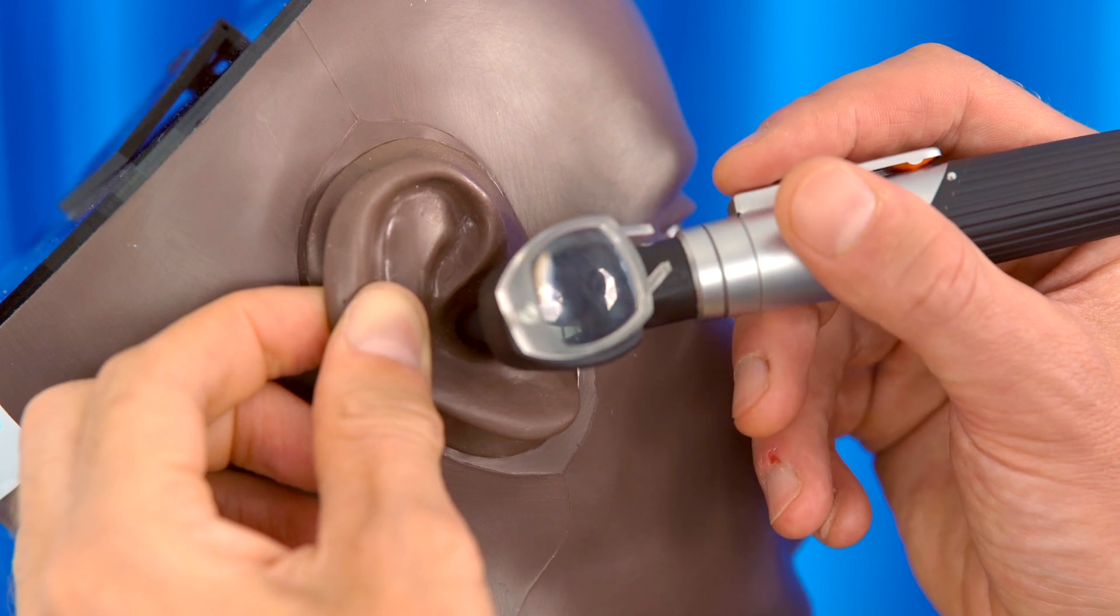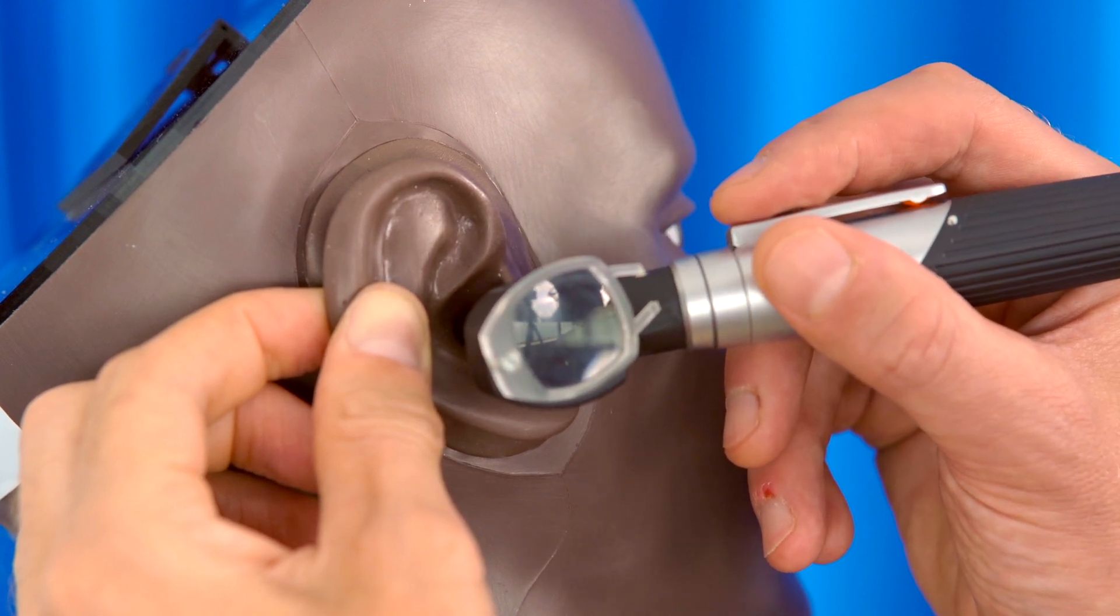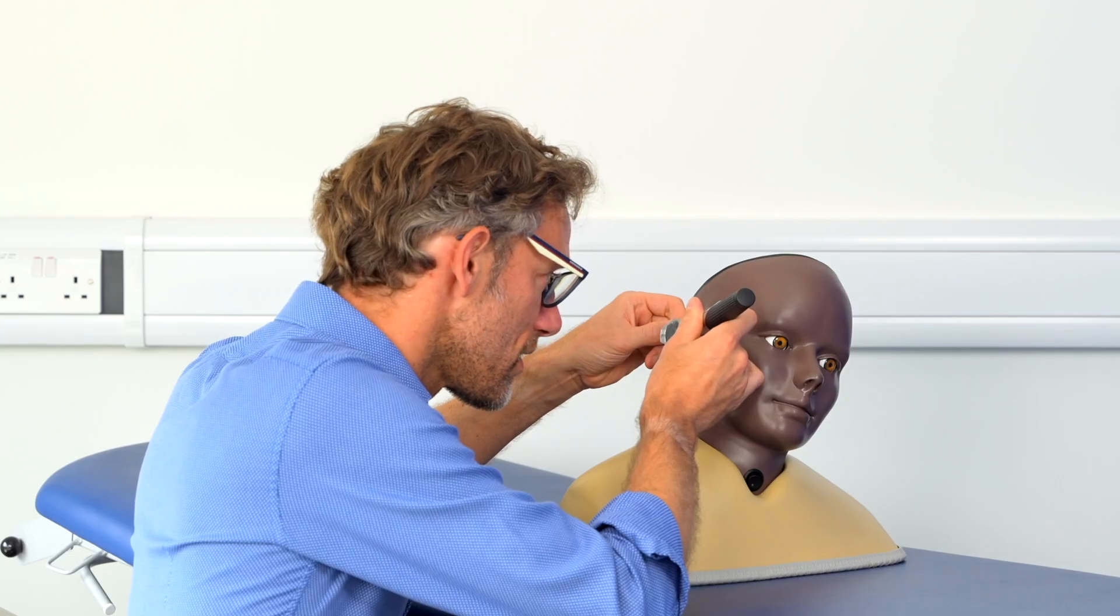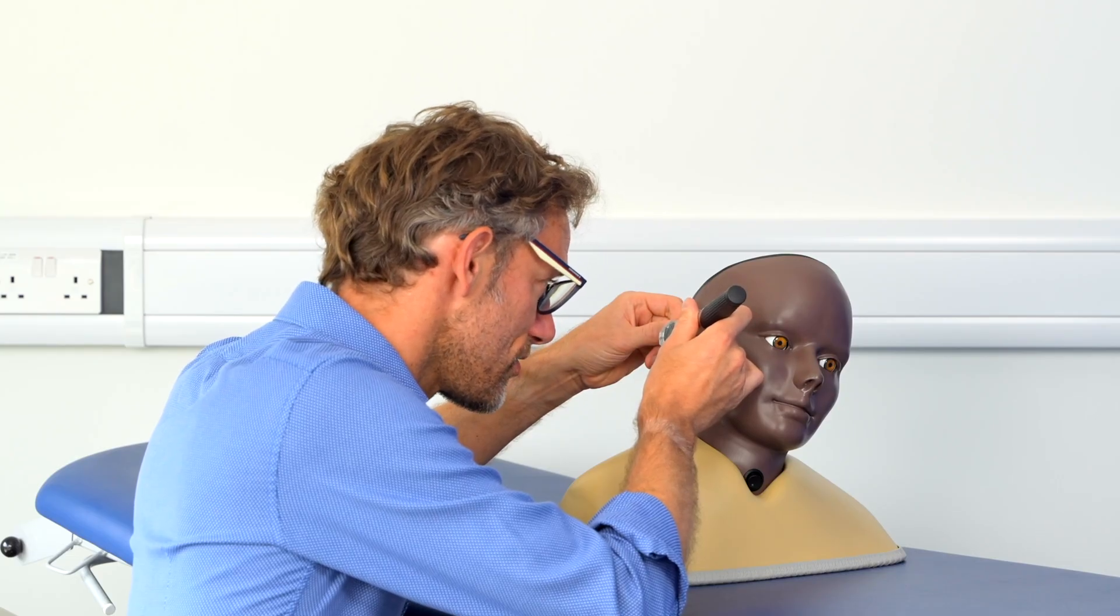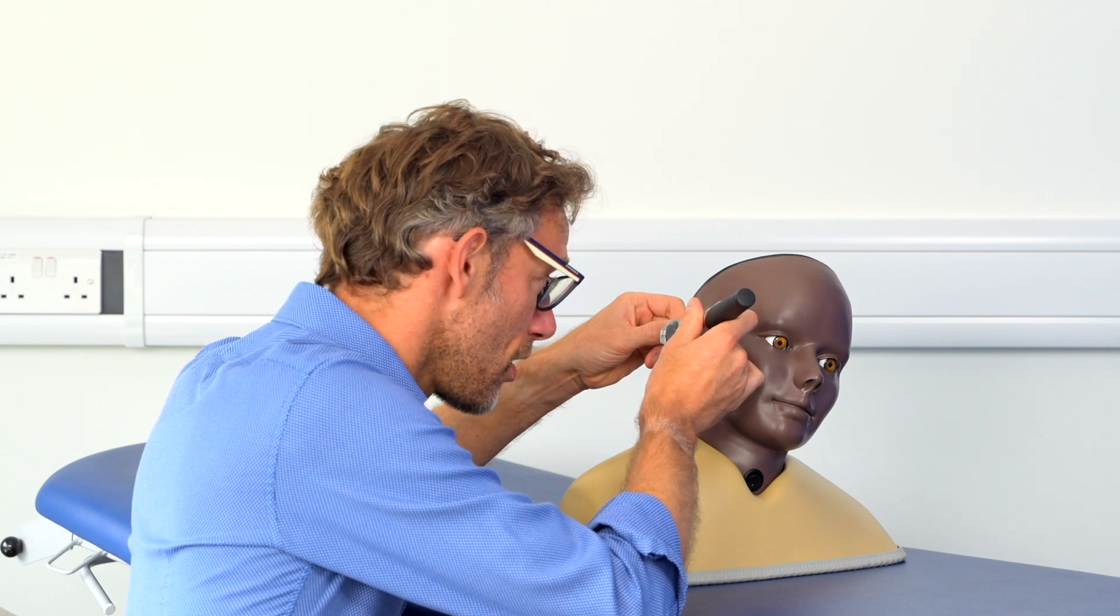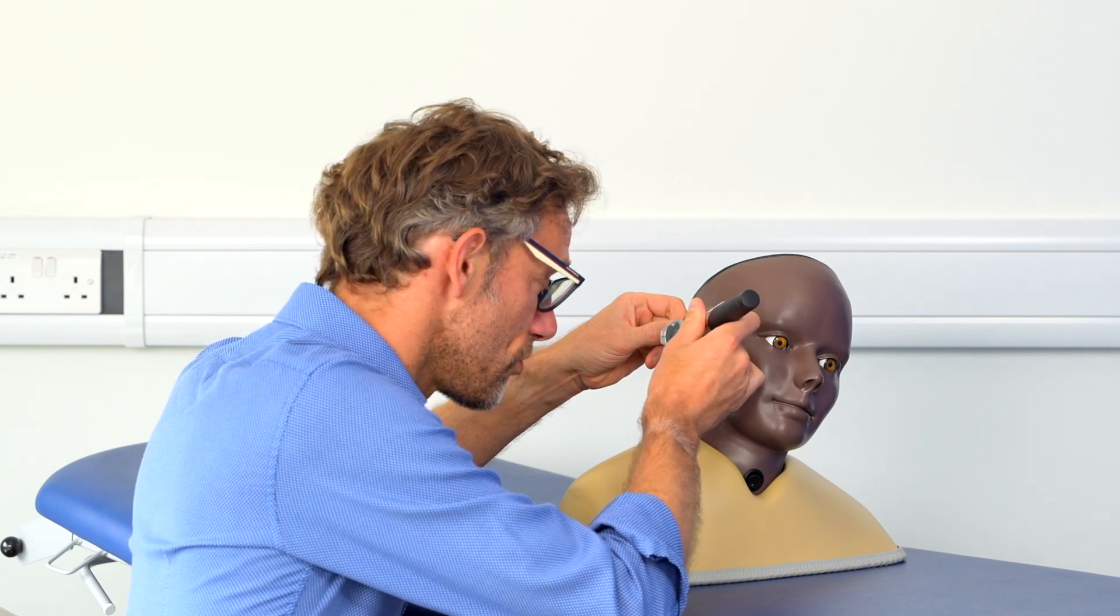I can't see bleeding, swelling, foreign bodies, wax, or any debris. And again, with the tympanic membrane, I can easily see the ossicles, and I can't see any evidence of previous surgery.